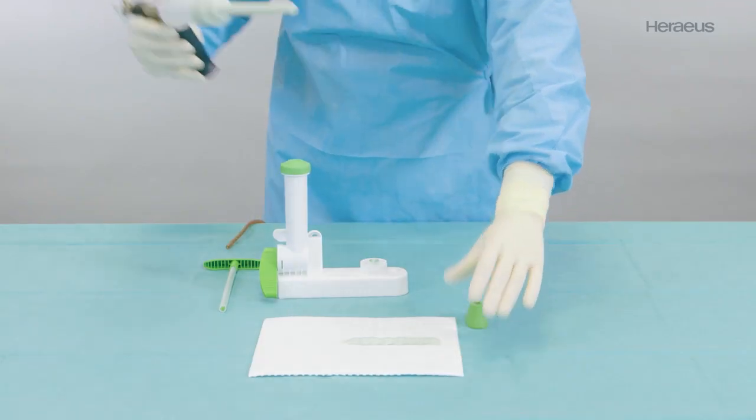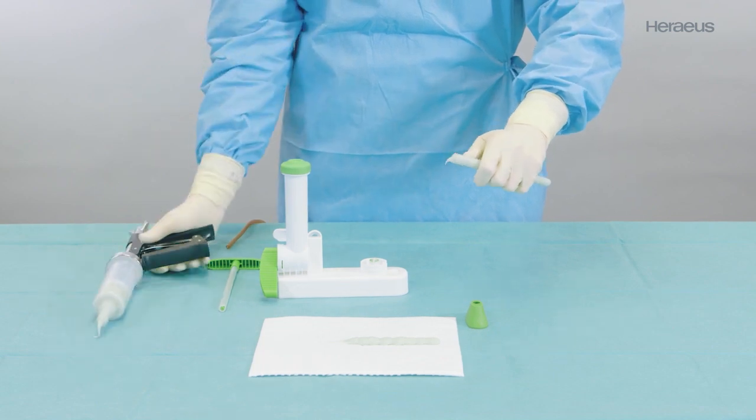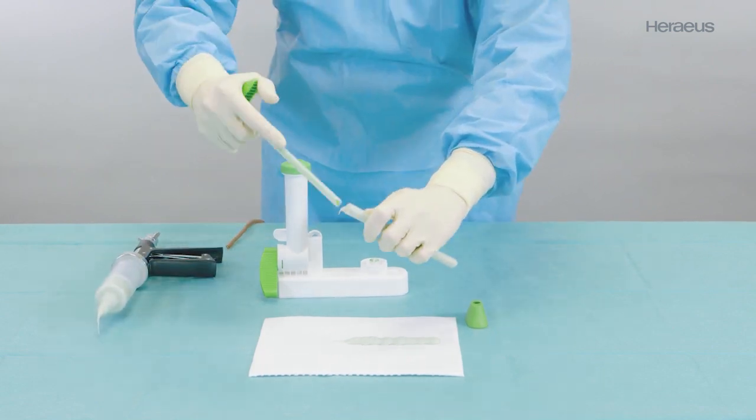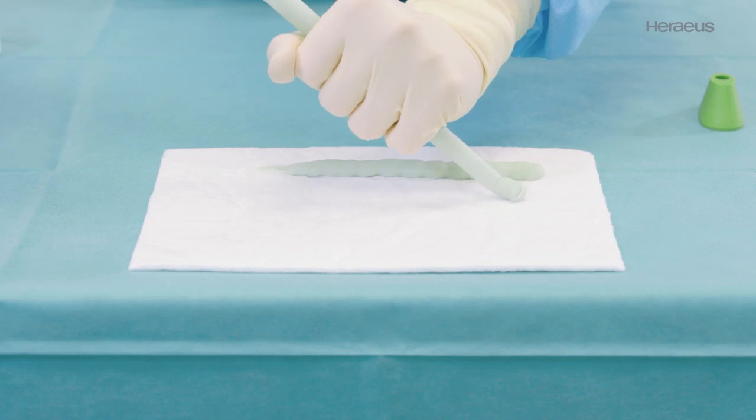Break off the nozzle at the predetermined breaking point. You can expel the remaining cement out of the application nozzle with the aid of the mixing rod.